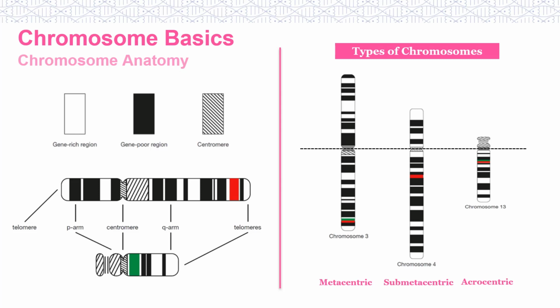During analysis, technologists will match and analyse chromosomes according to their banding pattern to look for abnormalities. Once all the chromosomes are analysed, they can be aligned in order of autosomes, chromosomes 1 through 22, and then the 2 sex chromosomes, X and Y, to produce a karyotype. A normal karyotype is 46,XX or 46,XY.